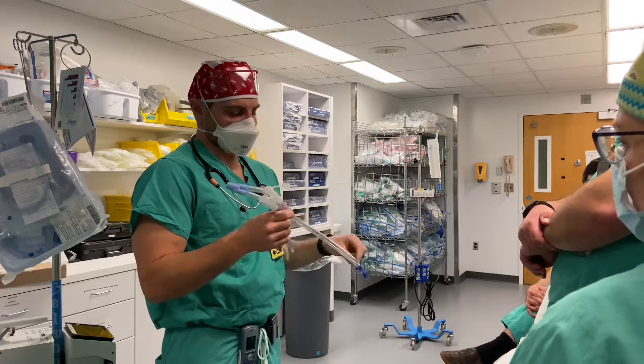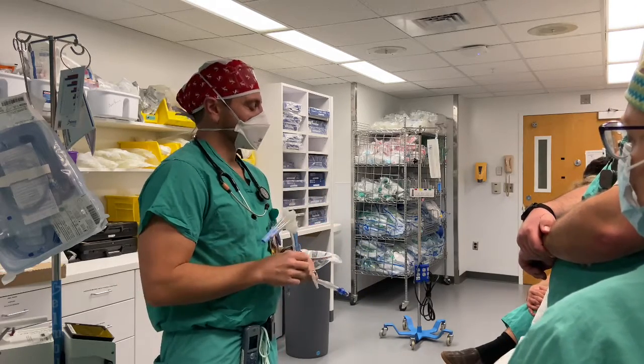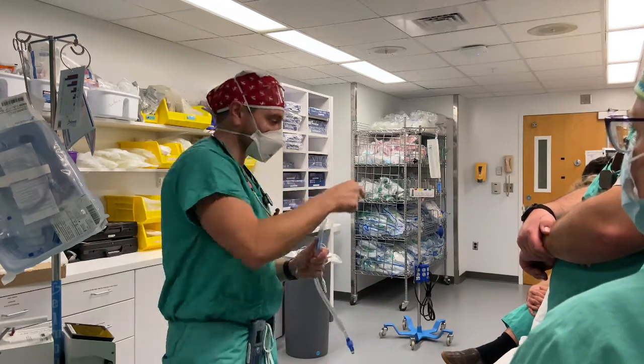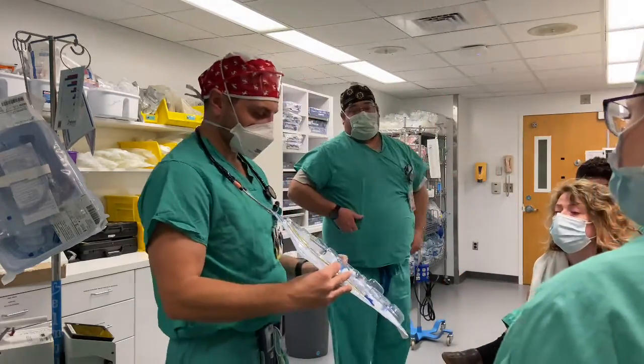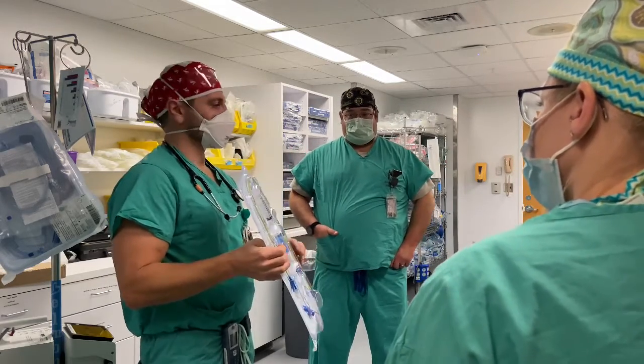And it's a little bit bigger lumen most of the time than when you have a balloon sitting in your single lumen tube. And it allows the lungs to deflate better. So when you use a blocker, which I'm not going to take out of the case here, a blocker is not designed to breathe through. It's just really designed to occlude an airway, one side or the other.